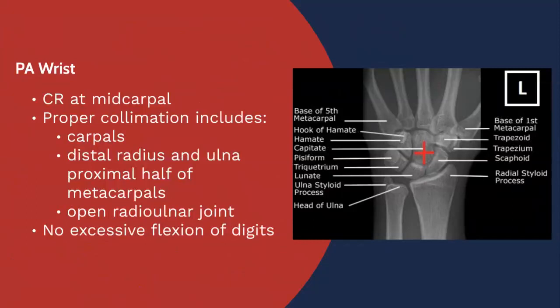I'm partnering with Wiki Radiography to provide these images — I did alter the image slightly by adding a red crosshair where the central ray would be located for this PA wrist image and changed the collimation slightly. The central ray should be at the mid-carpal, and ideally when we see the image it should be centered on the capitate, which is the largest of the carpal bones. Proper collimation includes all carpal bones, the distal radius and ulna, and the proximal half of the metacarpals.